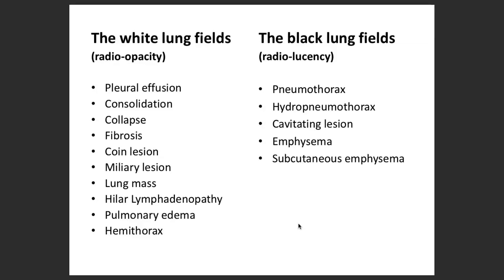We are concerned about the heart, but what about the lung? The lung can also have some common problems which are seen in day-to-day life as well, so I have tried to include them as well.